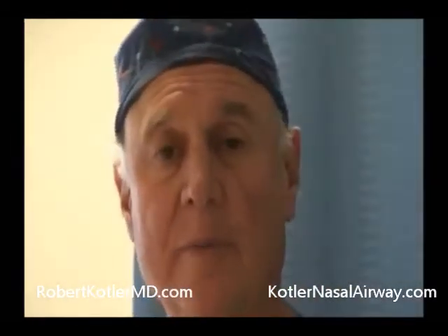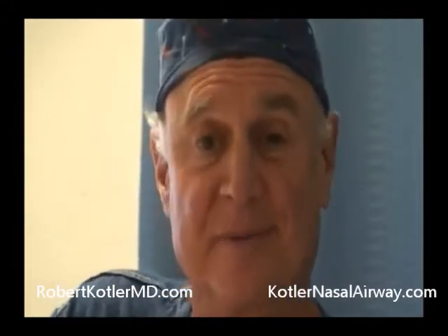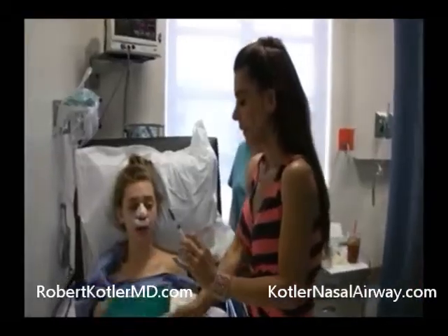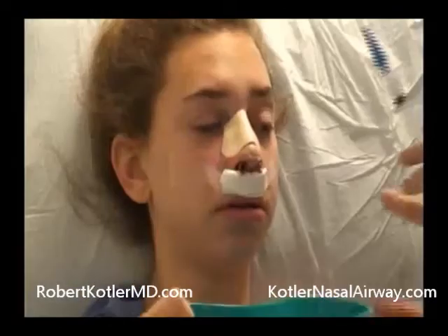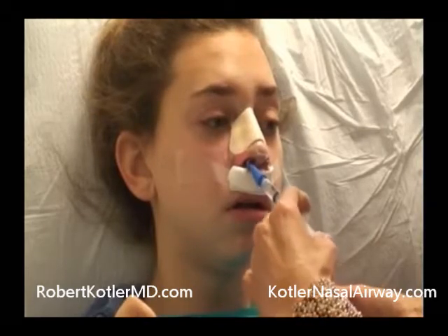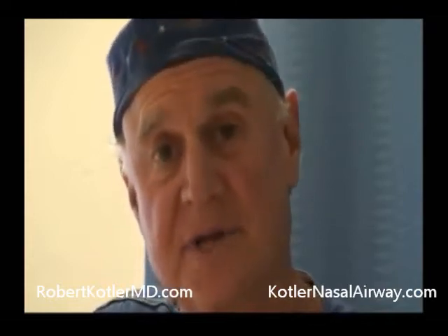It's very important that the family feel comfortable with the home irrigation. So we found the best time to confirm that everybody's on track with it is here in the recovery room. We'll ask whoever's going to be taking care of our patient at home to irrigate one side after Nurse Vicky has demonstrated it on the other side.